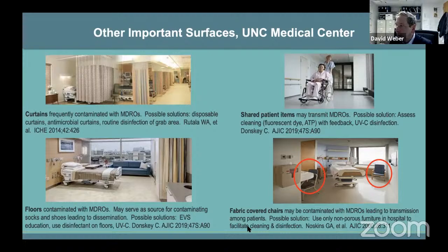Shared patient items, again, another study by Dr. Donsky, if not properly cleaned, can transmit multi-drug resistant organisms. Again, you can use a standard disinfectant, use fluorescent dots to prove they're cleaned, or you can use something like UV disinfection.